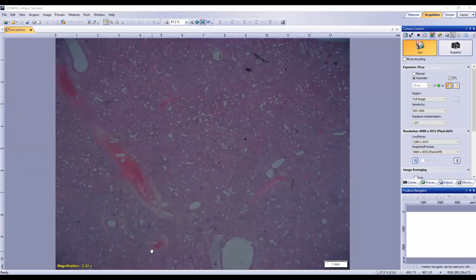And that causes type 1 pneumocyte damage and alveolar damage, basically, and bronchiolar damage too. Yes, exactly. Yep, perfect. Well done. And I think, even for boards level, if you got that follow-up question of, what's the pathophysiology, you've got your descriptive part of the slide, and then a follow-up question, describe the pathophysiology. I think that should get you all or most of the points.